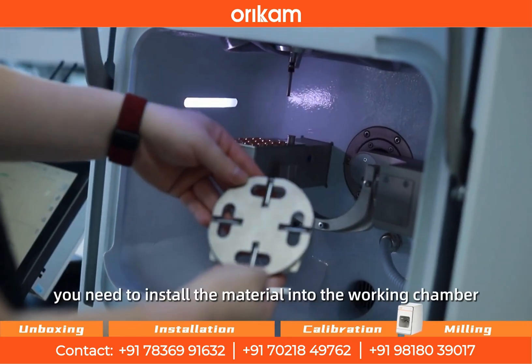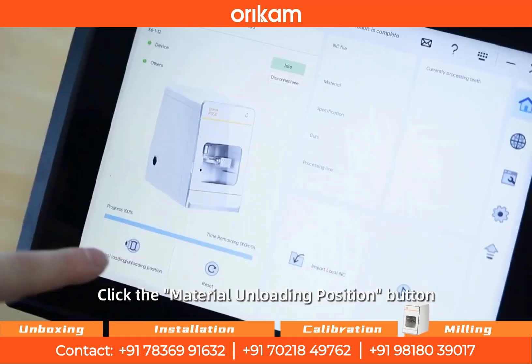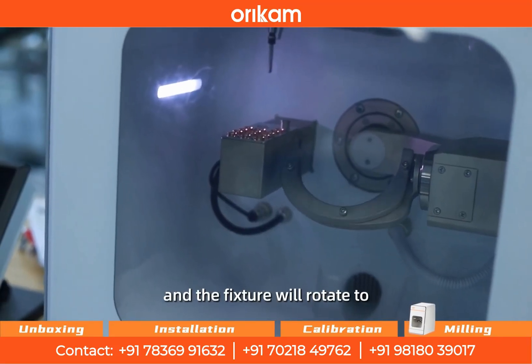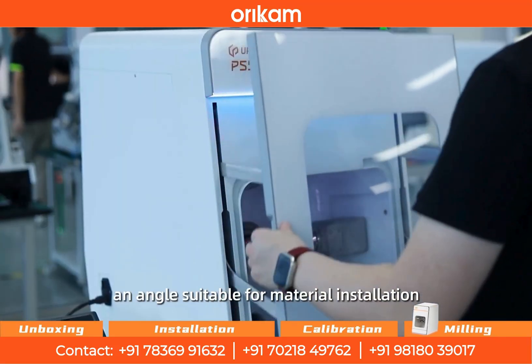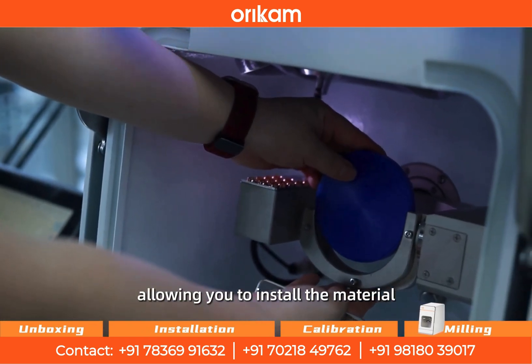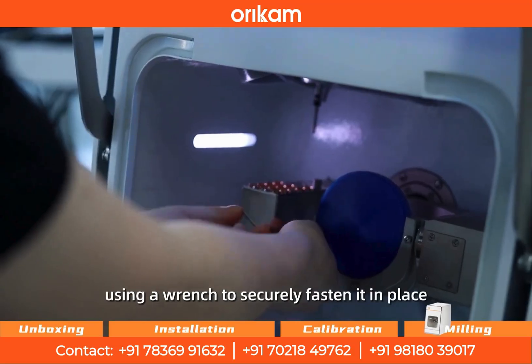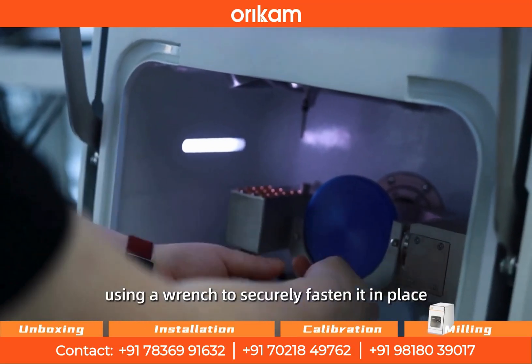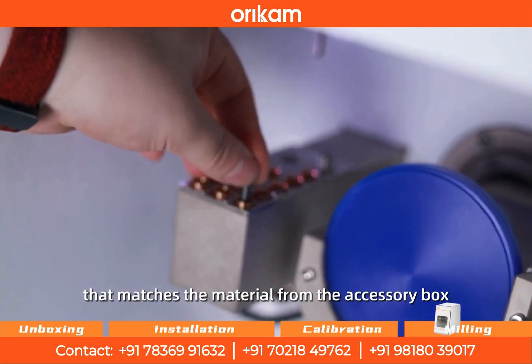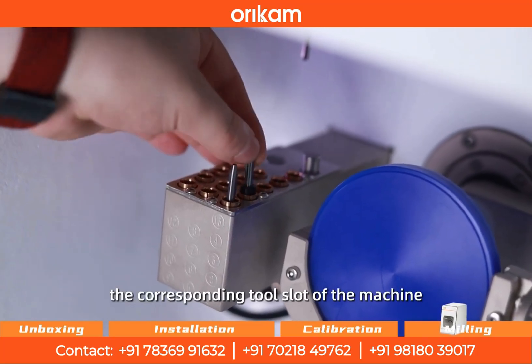Before starting machining, you need to install the material into the working chamber. Click the material unloading position button in the software interface, and the fixture will rotate to an angle suitable for material installation, allowing you to install the material. Take out the material to be machined and mount it onto the fixture, using a wrench to securely fasten it in place. Take out the milling cutter that matches the material from the accessory box and install it into the corresponding tool slot of the machine.